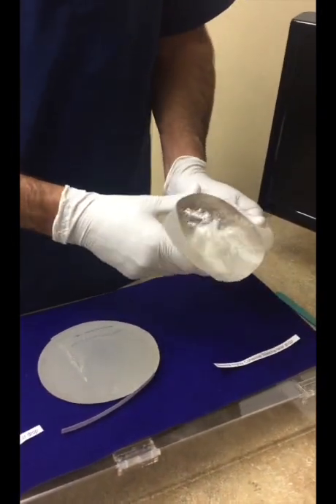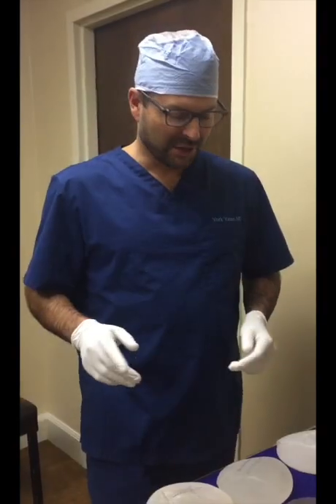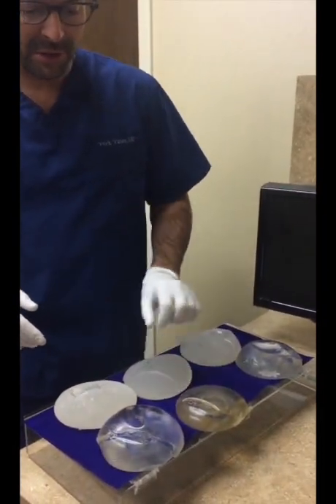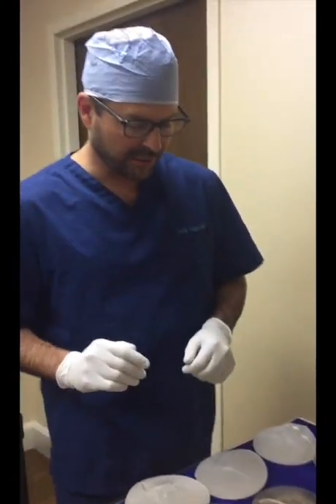That's pretty interesting. These implants really do hold their shape, even if they have been injured. Now I want to test the stability of these implants once they've been cut. We've cut implants of different types: Sientra teardrop, Sientra round, Mentor teardrop, Mentor round, Allergan teardrop, Allergan round — I've cut all these in half.